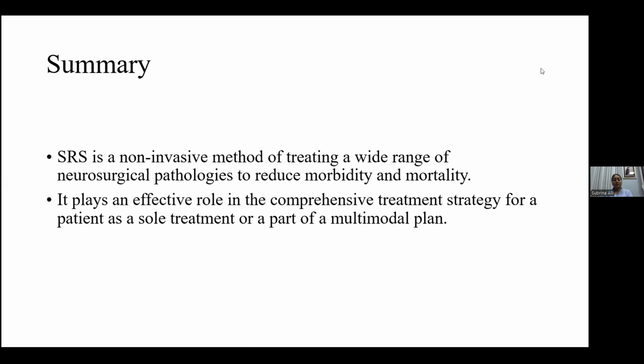So in summary, stereotactic radiosurgery is a good non-invasive method of treating a wide range of neurosurgical pathologies. What we aim to do is reduce both the morbidity and mortality of these patients. It does play an effective role in the comprehensive treatment of the patient, not only as a sole treatment, but as part of a multimodal plan as well.